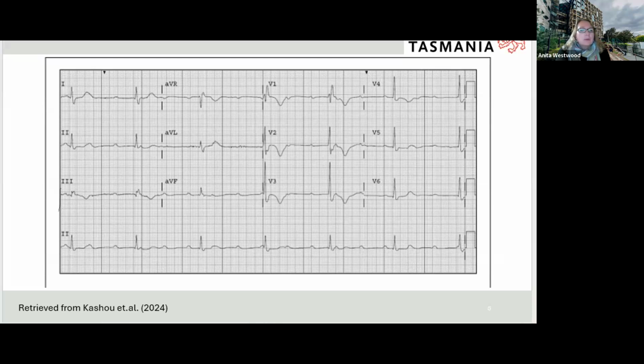maybe you can explain it better, Georgie. I'm trying to make sure that everybody understands, because if you haven't got the markers on there for your 6-second strip, you might actually have to count it out, especially if it's a slow rhythm. Do you know what I'm trying to say? I use that method as well, Michael, because it's good in the sense that you can cater for slow rhythms, fast rhythms, and irregular rhythms.